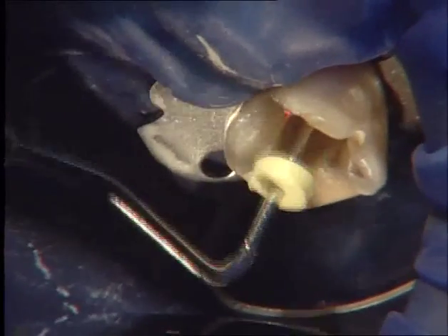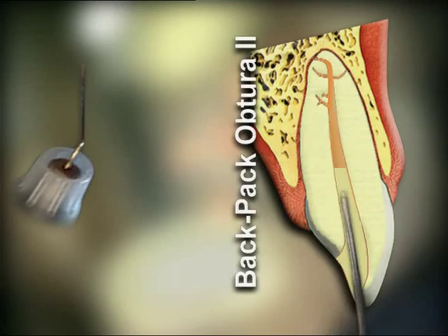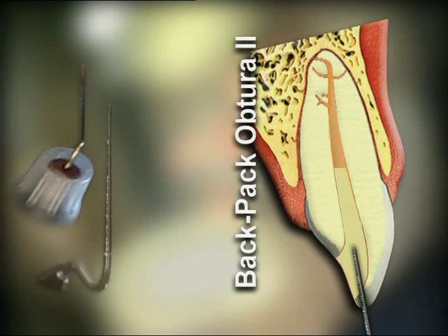The best proven system for this technique is the Obtura II gutta-percha gun. With this system, you can apply and condense thermoplastic substances in short portions. The hot, pre-curved needle is inserted into the canal until it comes into contact with previously packed gutta-percha apically. Pluggers are used for compaction. Through a series of gutta-percha injections and vertical compactions, the canal is filled completely step by step.